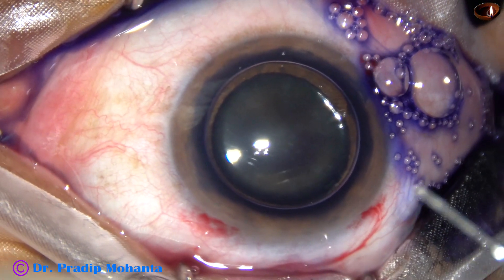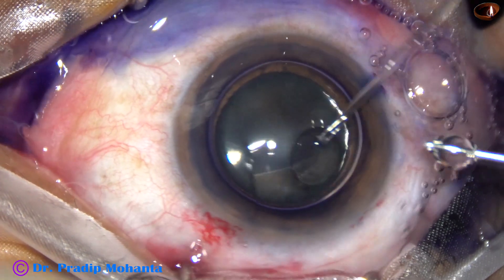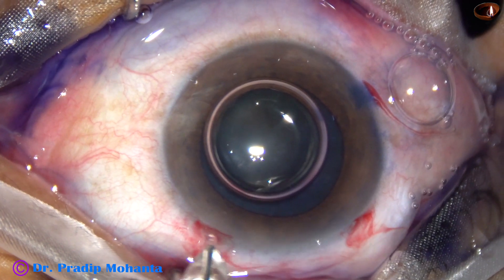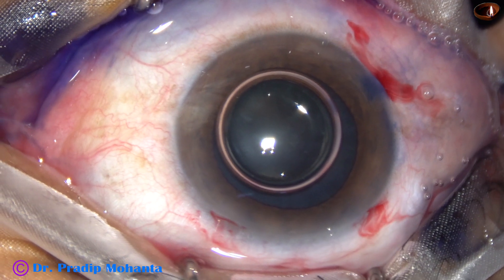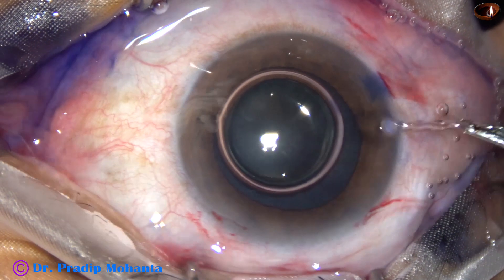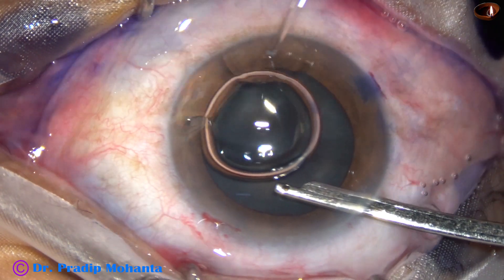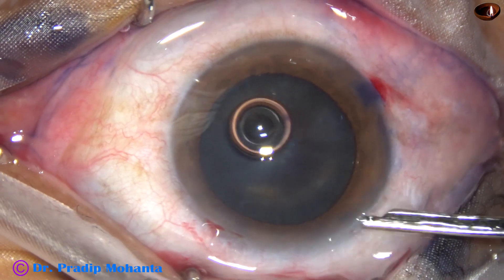This is a bit of adrenaline because I see that the pupil is not fully dilated. Let us see if adrenaline has some effect or not. Yes, adrenaline has caused more dilatation.